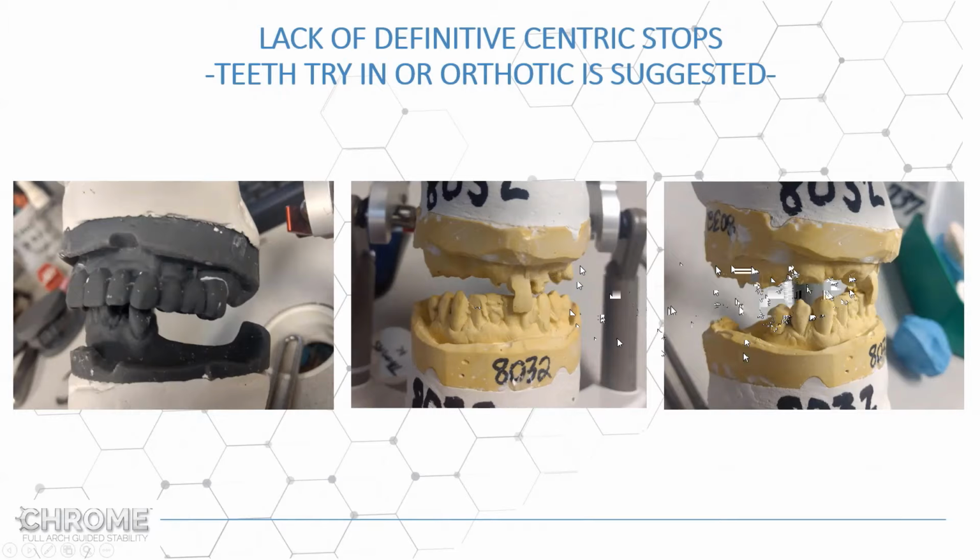They did that. We did open the vertical. You see a deep class 2 here. And we continued with the case, and it was successful.